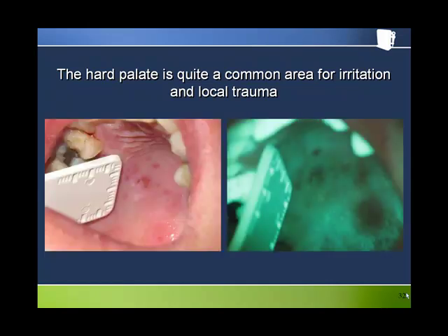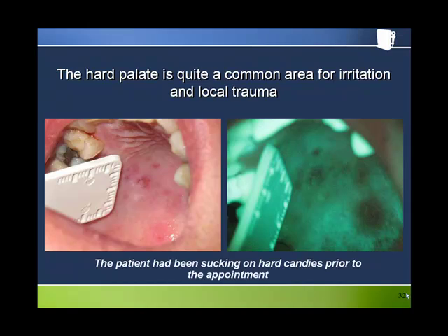This is an example on the hard palate of inflammation — a quite common area for irritation and local trauma. The dark areas under Velscope correspond to the irritated and sore-looking areas under white light. As it turns out, the patient had been sucking on hard candies before coming to the dentist. This is a good example of the importance of patient history in trying to understand the nature of soft tissue abnormalities. The soreness and inflammation have an obvious explanation here — but if this same presentation had occurred in a 50-year-old patient with a history of drinking and smoking and no other obvious acute cause, we might have approached it differently.